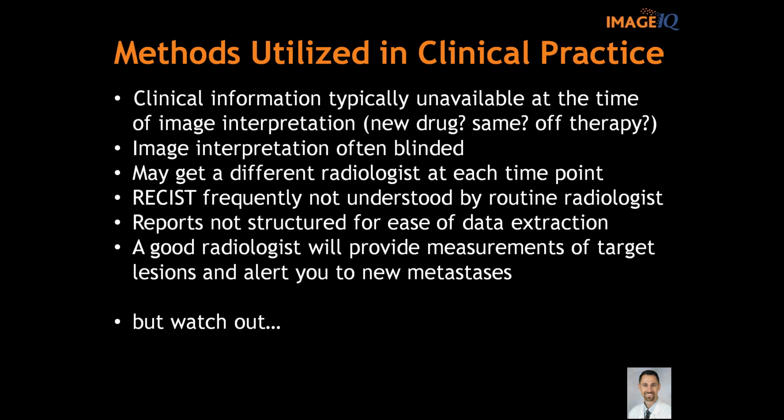So could you argue that, sorry, Andrew, could you argue that you may get radiologists that would pick the easier ones to sort of measure because you can reproduce them, but in fact, those are probably the ones that you don't want to look at. You want to look at the ones that are irregular shaped that could be metastatic?